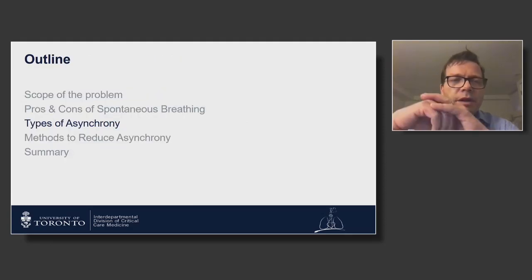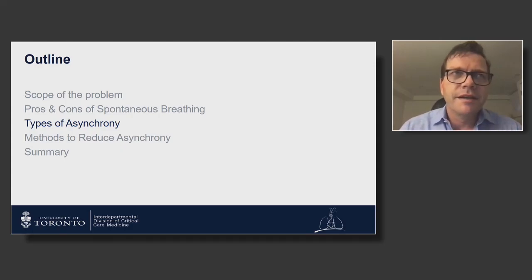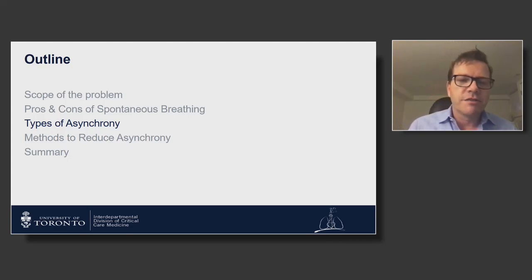So now let's talk about synchrony and asynchrony. Once we have patients breathing spontaneously and initiating breaths, this now implies that we have to get the ventilator to pay attention to the patient, and ideally they should work together. So if something is synchronous, that means that the ventilator is delivering a breath when the patient is making an effort, and the ventilator at the same time is not blowing air into the patient when the patient is trying to blow out. Next slide, please.